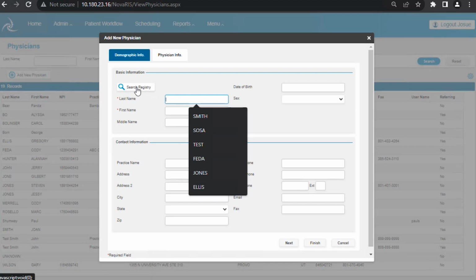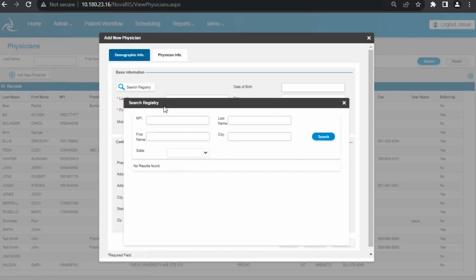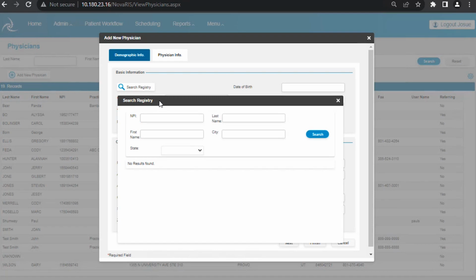One of the things that normally ends up happening is that some patients will not even know the name of the doctor, only the last name. If, for whatever reason, it's a doctor they have had for many years, for my grandfather, for my father, for me, and for my kids, most likely you also just know the doctor maybe by the last name or even a nickname.